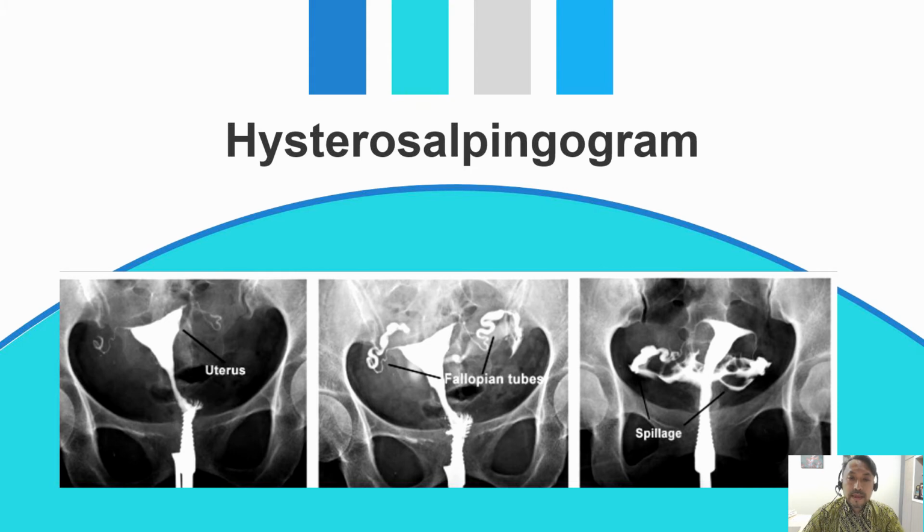The next step is you're going to test whether the patient has patent tubes or not. By using HSG, or hysterosalpingogram, it will be done by the radiological colleague. It's by using an X-ray and then a contrast study.